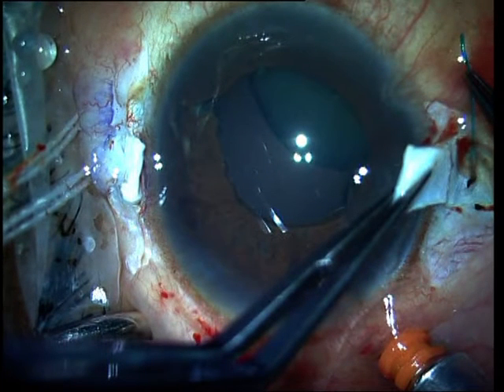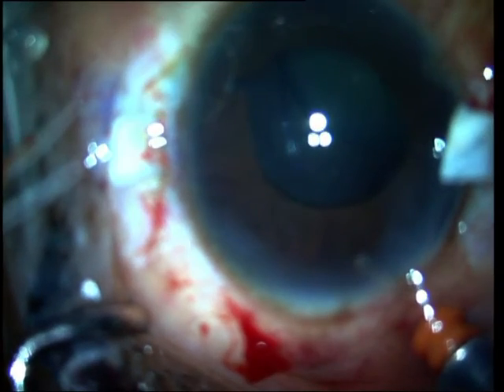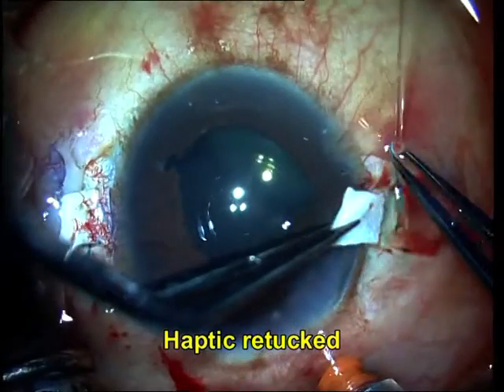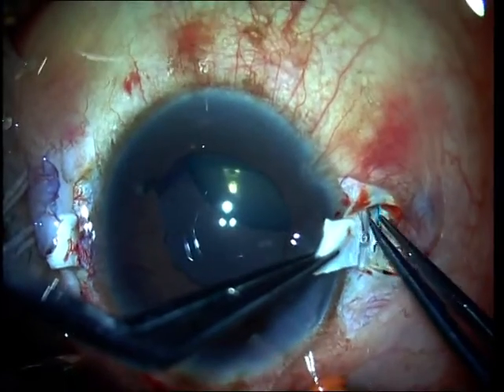Now if this situation does happen, remember that it's relatively easy to handle. What you need to do is grab the haptic that you have on the outside of the eye and use it to maneuver the intraocular lens in such a way that you can now visualize the second haptic within the vitreous cavity. You then go in and grasp it with an MST forceps and exteriorize the second haptic out as well.